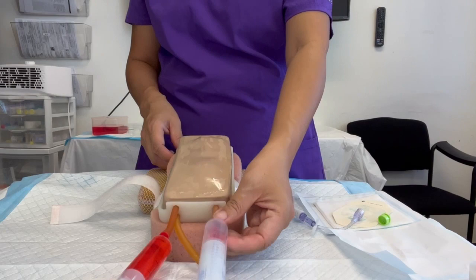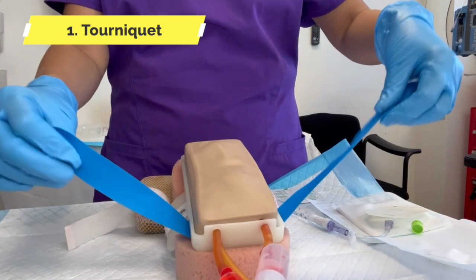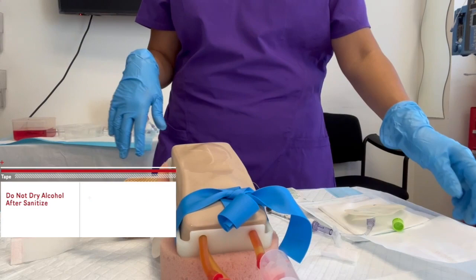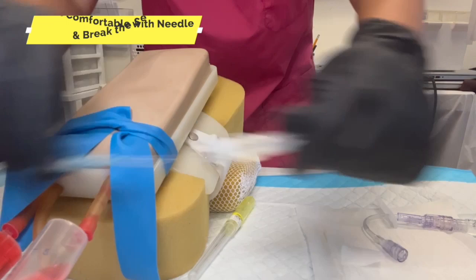Step one: tourniquet and wipe clean. I would prefer to do tourniquet here. Do we stick it in there wet, or do we stick it in when it's air dry? We do not blow on it — when we take this out, we break the seal.